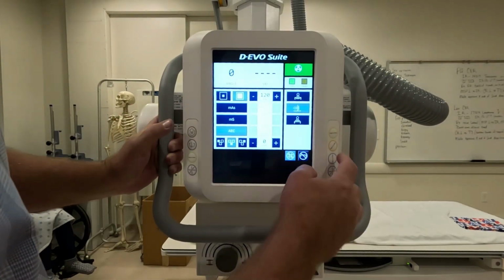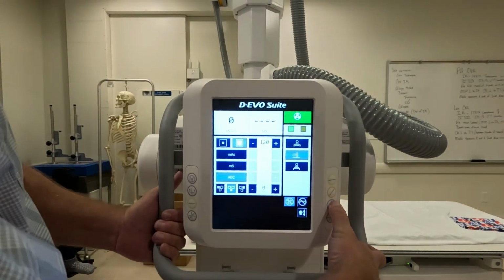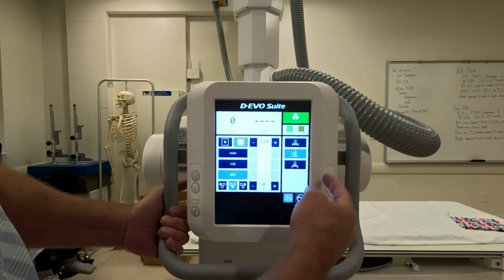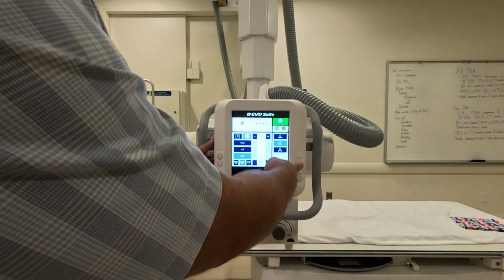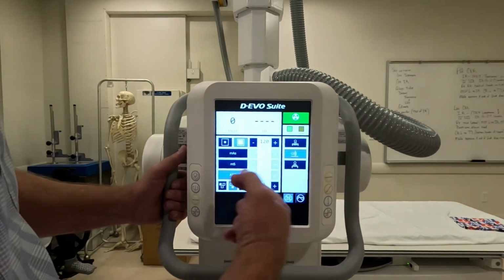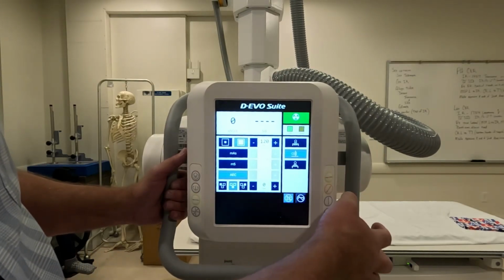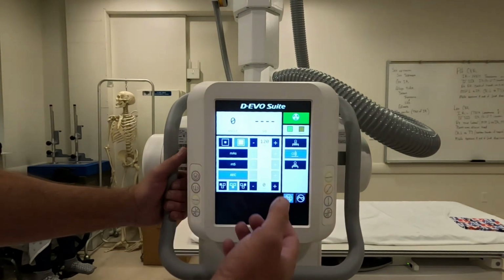Over here, what we have is an arrow that goes up and down. So if you push that button, it'll raise and lower the X-ray tube. This one is a little bit more complicated. They can't really do two that have the arrow pointing up and down, so this one represents going just across. Across the table, across the short axis of the table, crosswise is what we're looking at. So it's got two buttons to take it across the table.